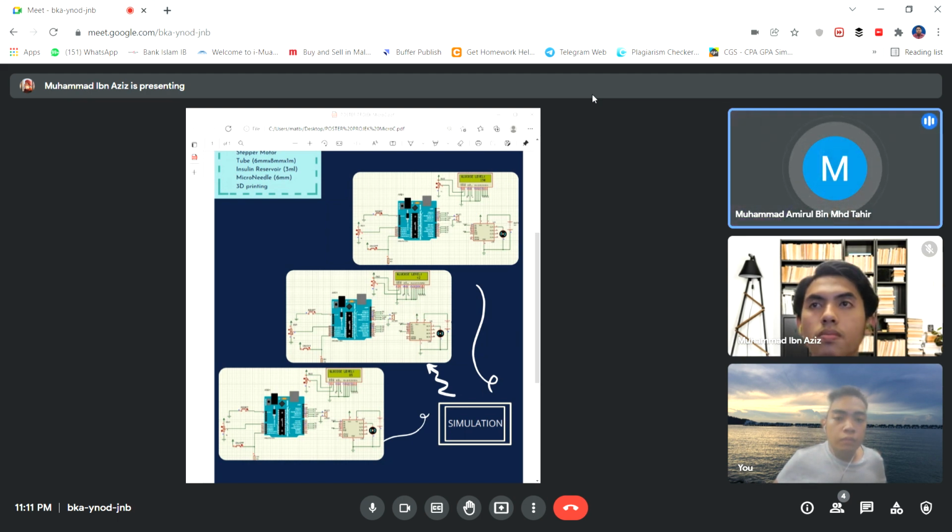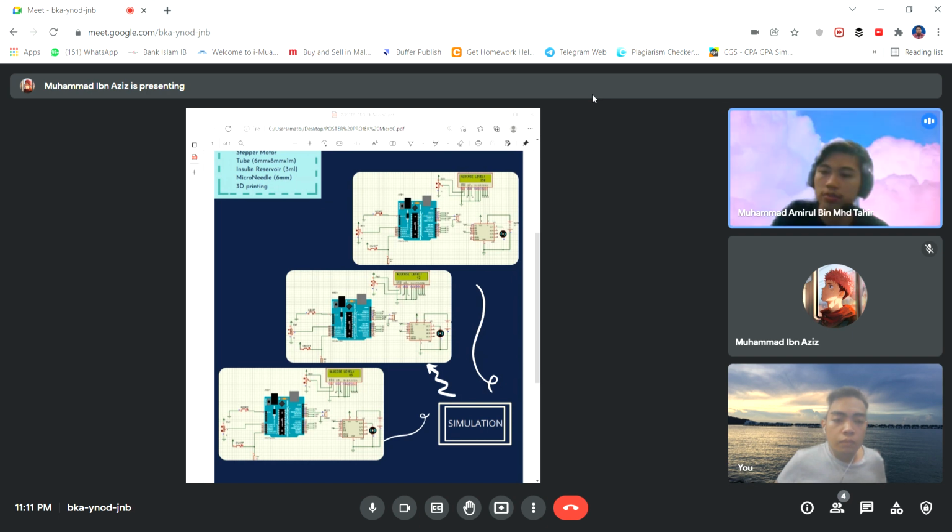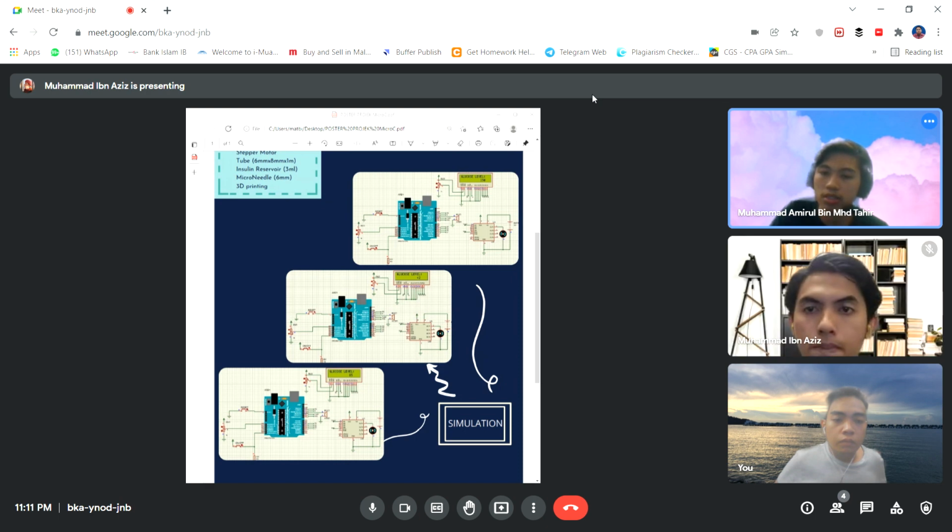When the monitored patient reading exceeds 150, the controller will engage the insulin pump and generate the buzzer, an alarm for a short duration. When the reading falls below 50, the insulin pump will stop and the buzzer will turn off.